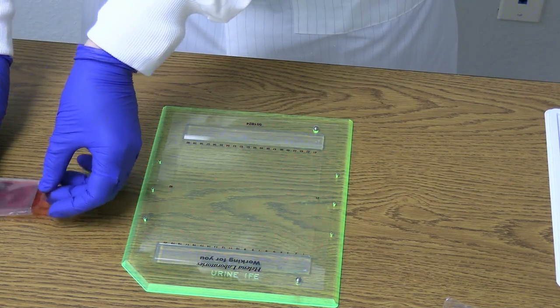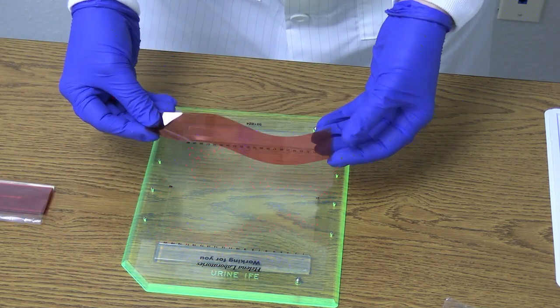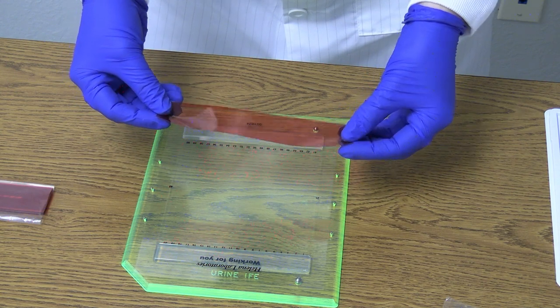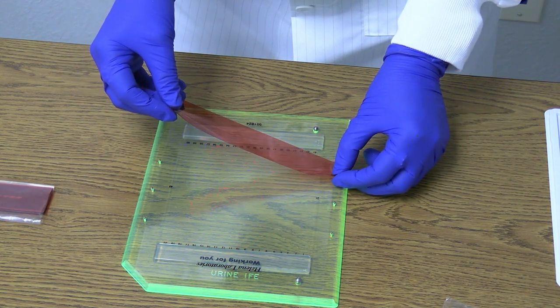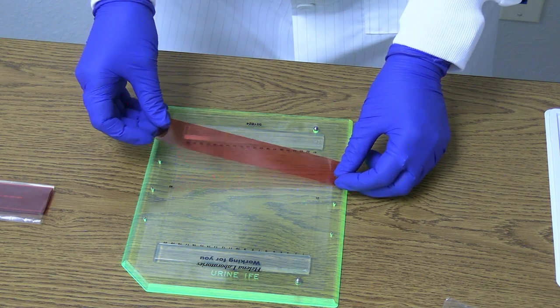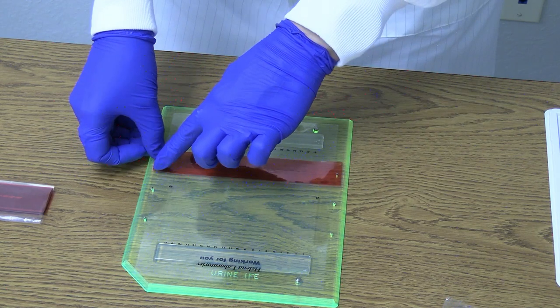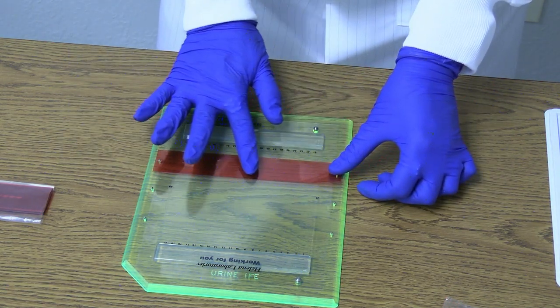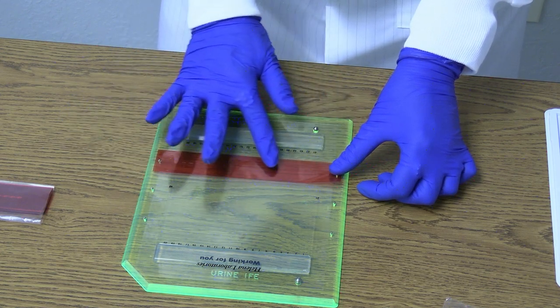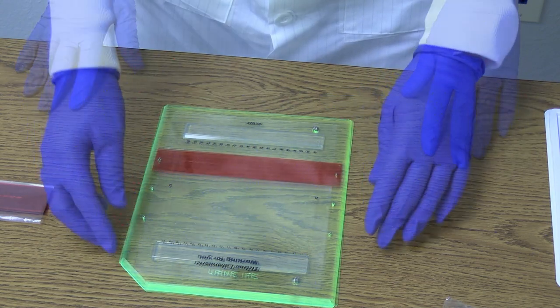Examine the urine templates. The urine templates have been marked with a hole in one corner. Hold the template so that the marked corner is in the lower left position. Align the template pin holes with the pins on the sides of the alignment guide and carefully slide the template over the alignment pins until the template contacts the gel surface. Apply slight fingertip pressure across the template, making sure there are no air bubbles between the gel and the template.